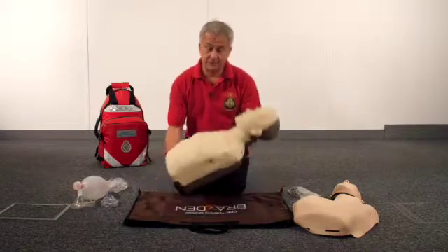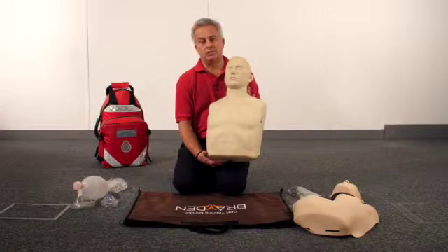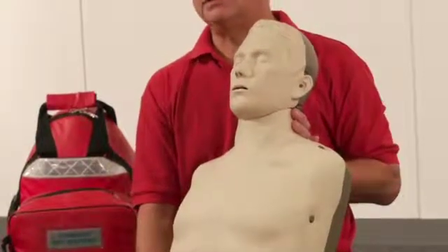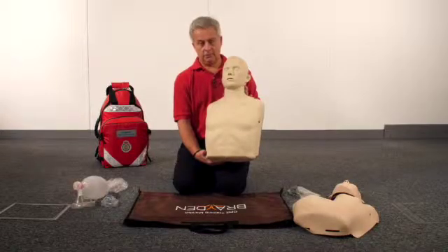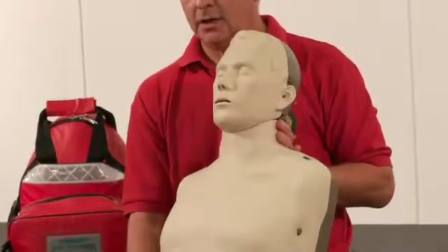The Brayden Mannequin is obviously an adult mannequin. We have recently introduced the Junior Conversion Kit. This allows you to convert the adult mannequin into a paediatric mannequin representing a 10 to 12 year old boy. This means you don't have to bring two mannequins to your training room — you only need to bring the Brayden and the Conversion Kit.